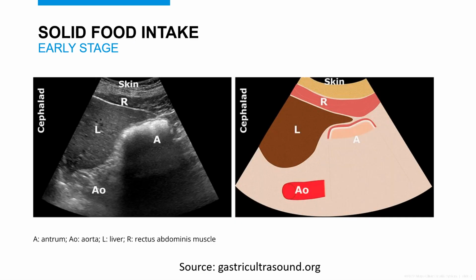Here we have a full stomach. We know that this patient recently ate because the solid material and air intake while the patient was eating is preventing the ultrasound beam from penetrating deeper into the abdomen. So we have the frosted glass pattern as appreciated by the white line that fades into the black dropout on the ultrasound screen. The antrum also appears distended with thin walls.